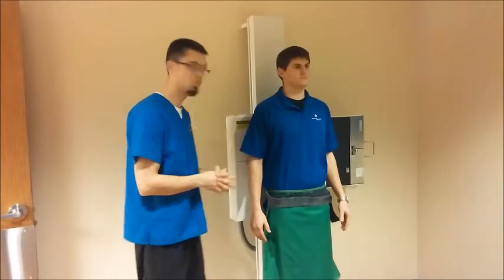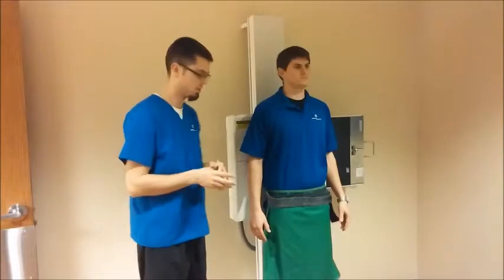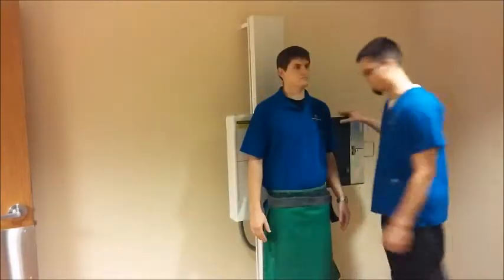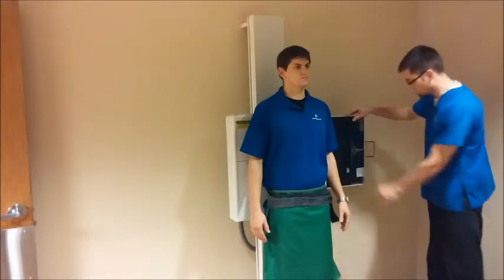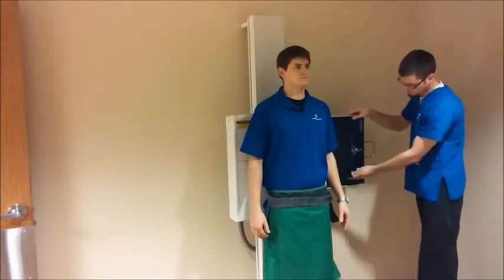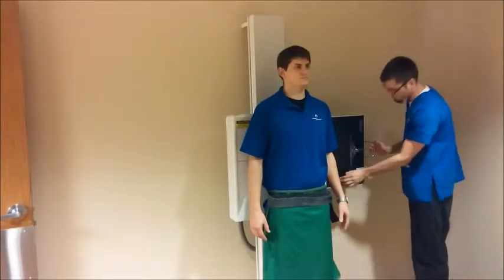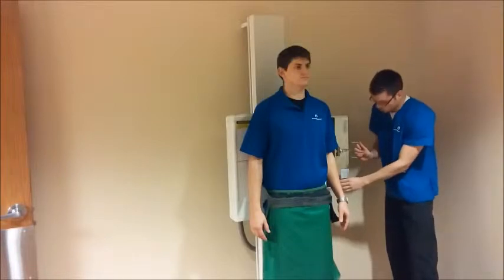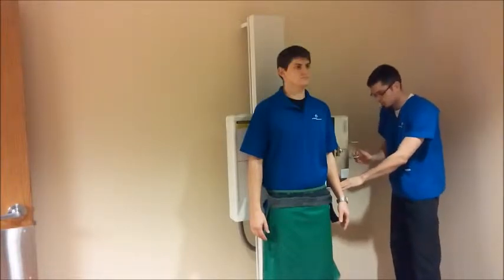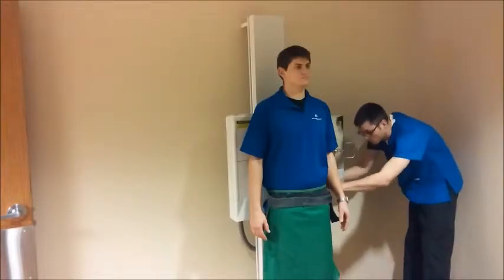Okay, the first projection that we are going to do here is the AP upright. This is performed at a 72-inch SID, and also it is performed on a 14 by 17 lengthwise position cassette. You'll want a left marker on the right side of the cassette, about 4 inches in at the bottom corner. You will also want to position so that the cassette is right at the top of the iliac crest.